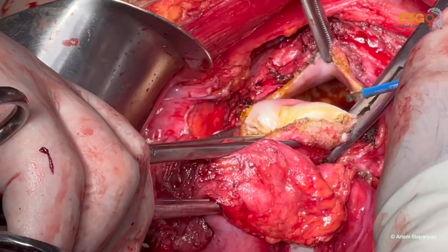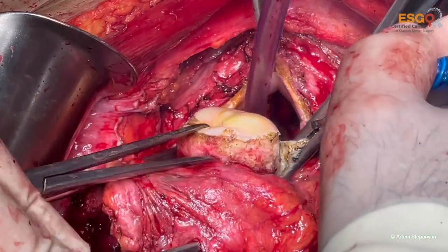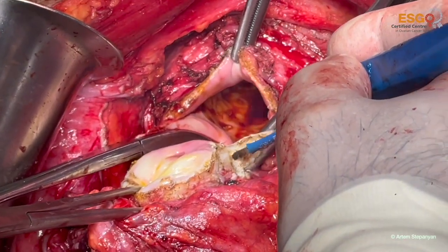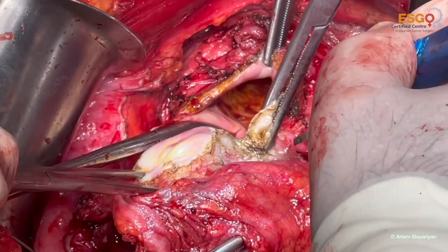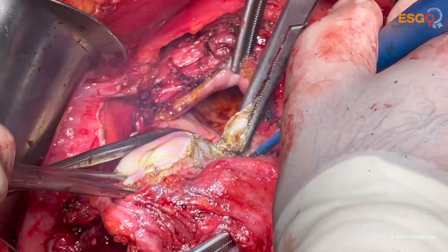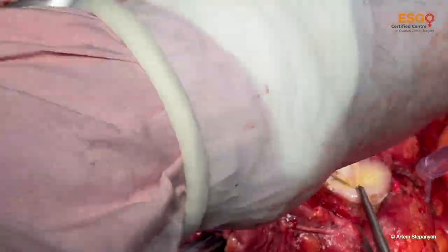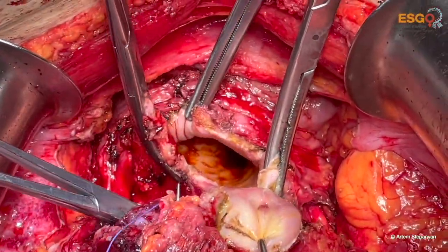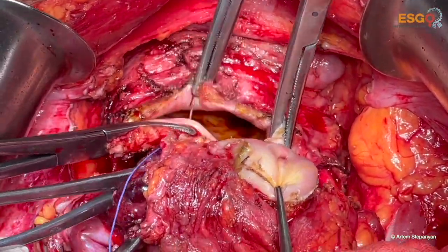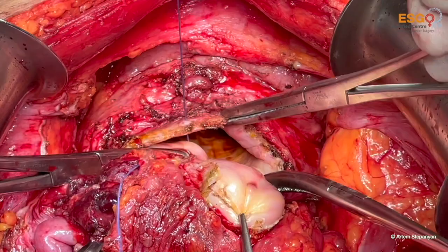Another Rogers is placed on the right fornix, and the tissues are cut and then will be sutured. And so we achieve the posterior vaginal fornix. Now the vagina is closed by double figure of eight sutures on both sides.